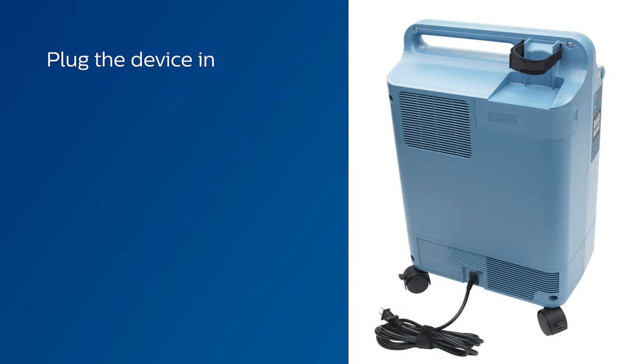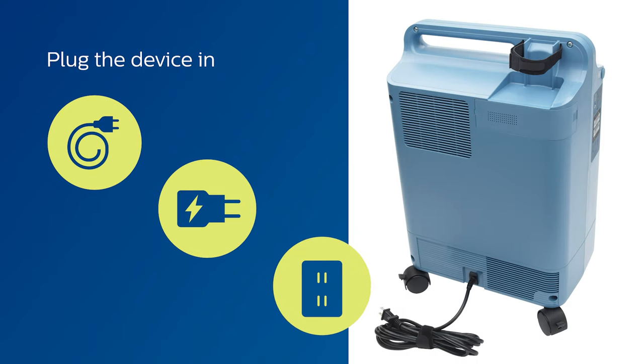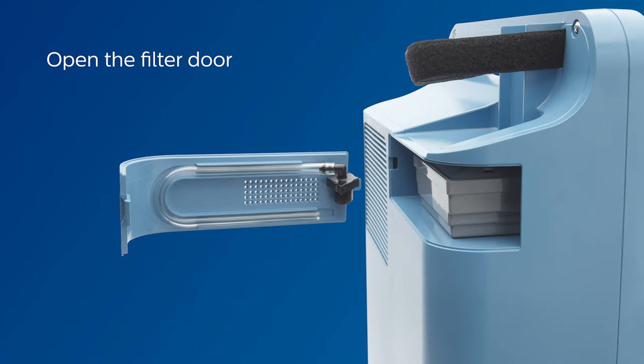Now plug the device into an electrical outlet. If you are using a humidifier, follow along with these steps as shown. Open the filter door on the back of the device, remove the humidifier connector tube from the back of the filter door, and replace the filter door.